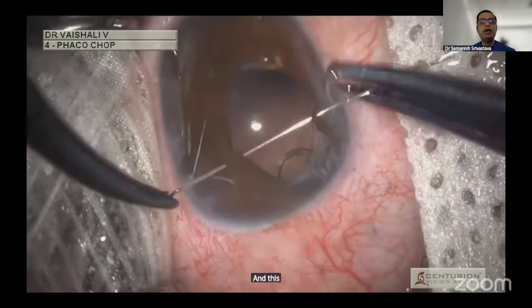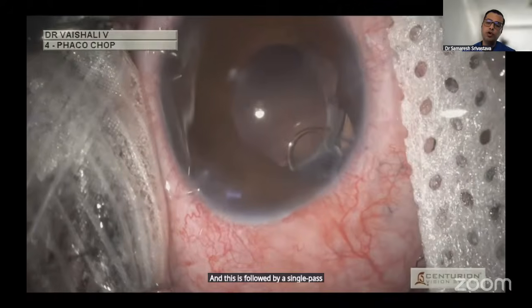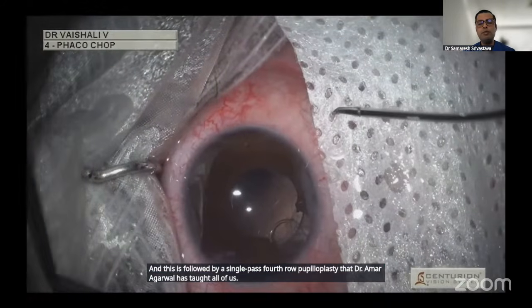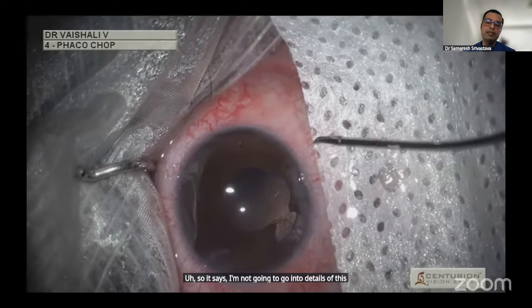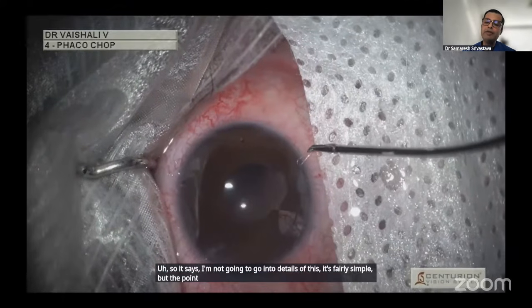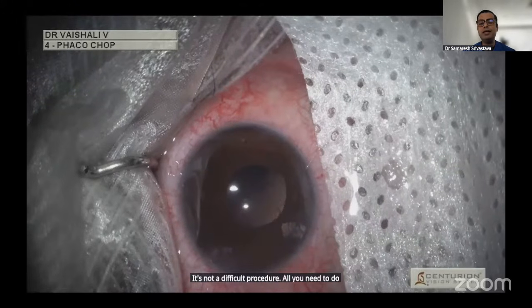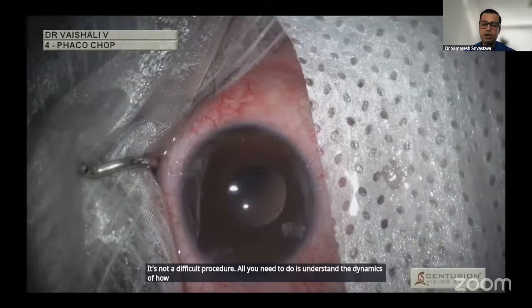And this is followed by a single pass 4-throw pupilloplasty that Dr. Amar Agarwal has taught all of us. So I'm not going to go into details of this. It's fairly simple, but the point is, it is actually a very simple procedure. It's not a difficult procedure. All you need to do is understand the dynamics of how to externalize the suture. And I think with one case, the learning curve is pretty much done.